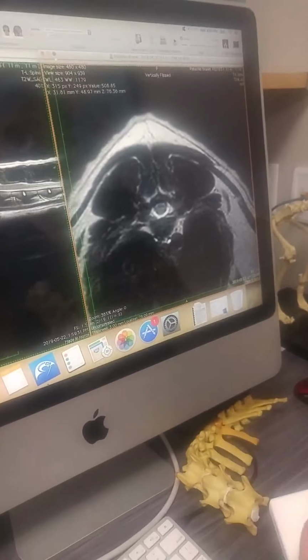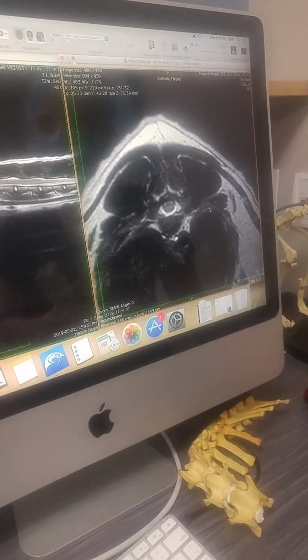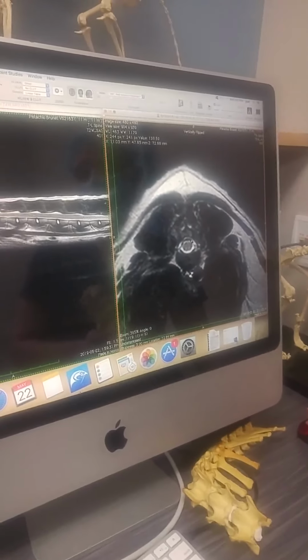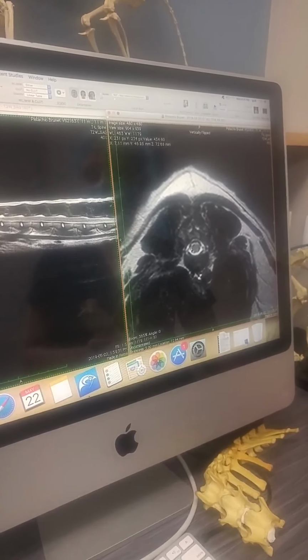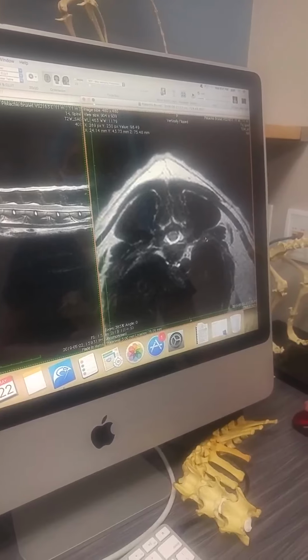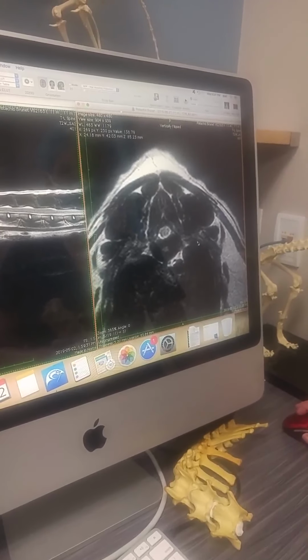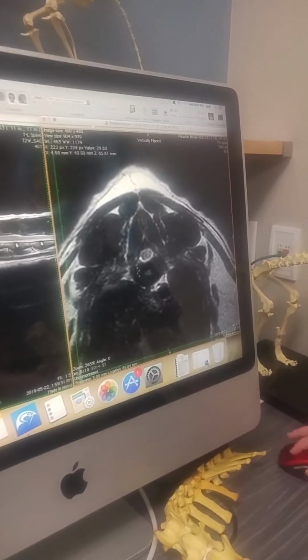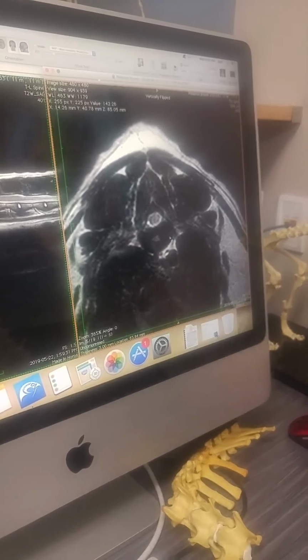And then what it allows us to do is, when I pass through there, you'll see that the shape of the spinal cord itself will change, and it's not going to be as nice and round, if that makes sense. So when I pass higher up, we can also start seeing that the bone around is kind of tilted, wiggling.